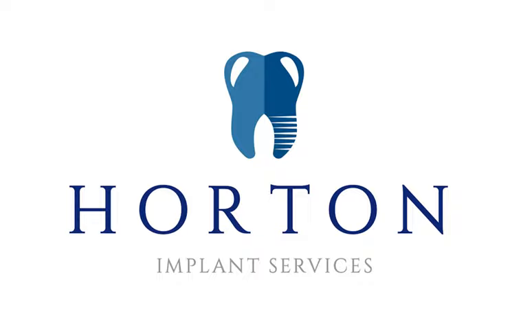That reference number is unique to the implant manufacturers, and that lot number is accountability, really. If anything goes wrong, it's traceability, just to make sure that everything's okay. And that helps the companies track as well. If anything did go wrong with those implants, some companies will take the implant back, for instance, if there's no integration, and have a little look and analyze it, which may or may not be of some use. It is really then easy to follow what's been placed on that patient, and it's good housekeeping. Then after that, we've got the post-surgical follow-up, and there are various ways of doing that.